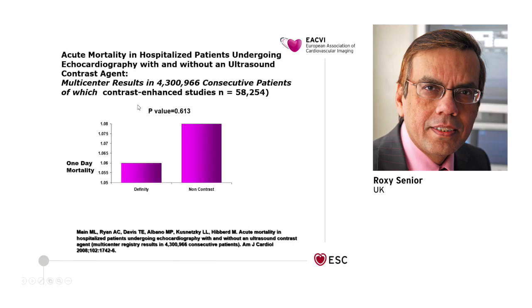So this is looking at acute mortality in hospitalized patients in a registry in the US, which included over 4 million consecutive patients, of which 58,000 had undergone contrast enhanced studies. And you can see that in the contrast echo group, patients did die within 1 day of administration of contrast, about 1.06%, but patients without contrast also died. So not giving contrast, just an echocardiogram, these patients did have mortality.